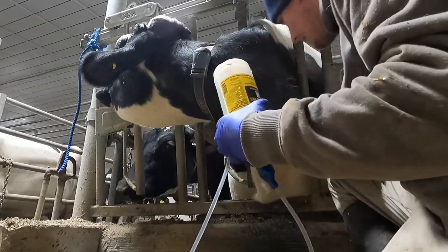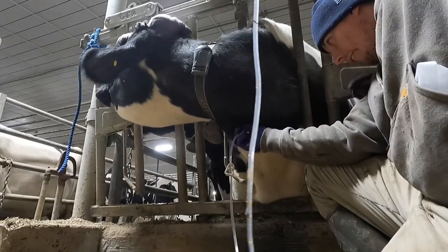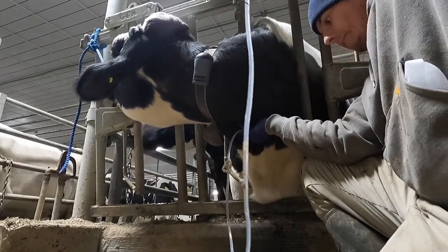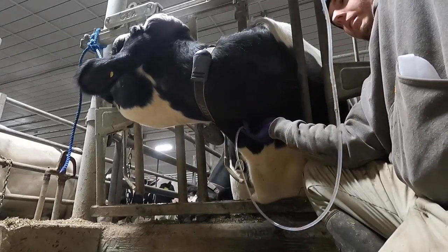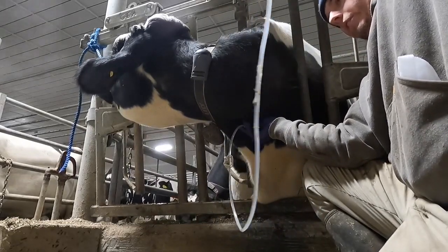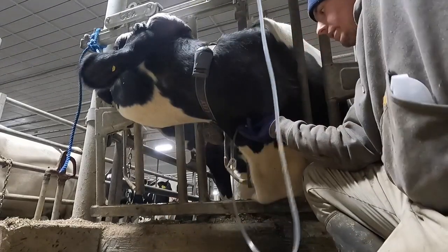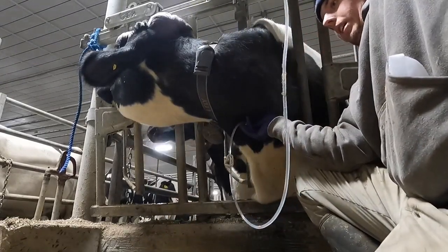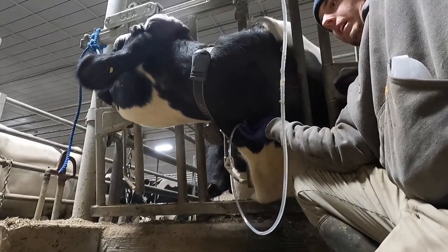It only took me about three tries. I'm just holding this up and letting it flow into her vein. If I bring it down like this, you'll see blood coming back out of the hose right there — see that? I do that after they jump around just to check and make sure I'm still in the vein.